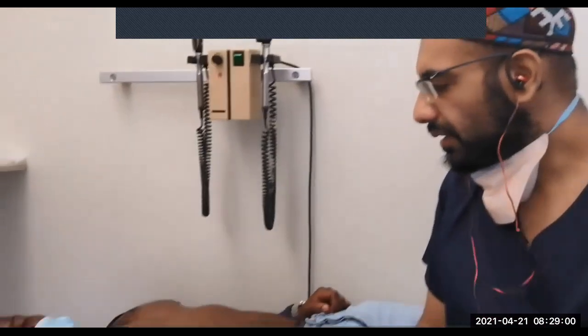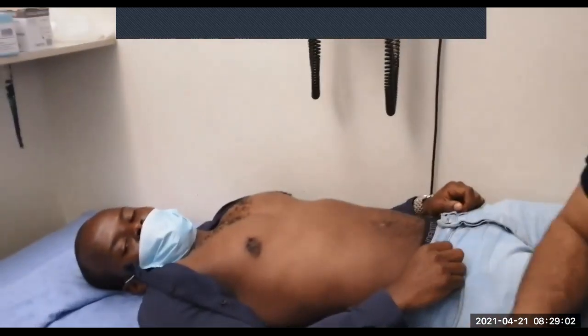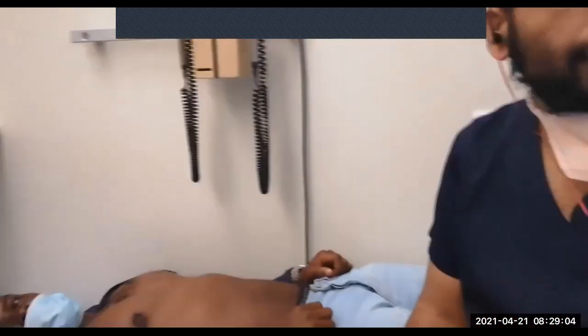Sorry. For a patient. So let's pretend that our young Dr. Biela here came to us with chest pain, and that we need to have a look at what's going on. We've done our ECGs, we suspect something's going on, but we're not 100% sure what could be going on. So that's when our echo comes into it, all right?